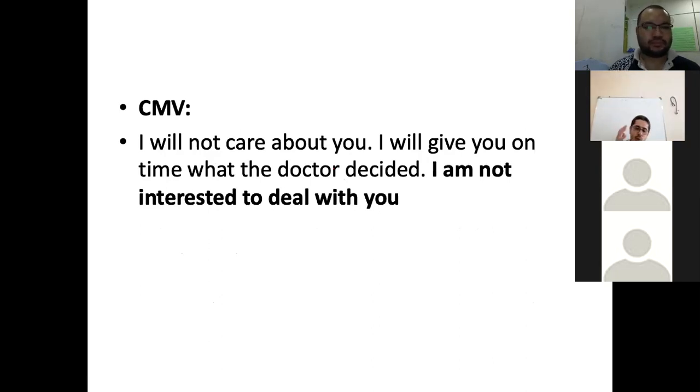So there will be asynchrony, patient-ventilator asynchrony, which is a big problem, and there is a lot of literature about asynchrony, how to manage asynchrony, because asynchrony leads to deterioration of the condition of the patient. The patient becomes uncomfortable, becomes hypoxic. So this mode you can only use if you have a patient completely sedated and paralyzed, like someone with head injury or someone who doesn't have breathing effort, because the ventilator will work by itself. We don't use this mode of ventilation nowadays.